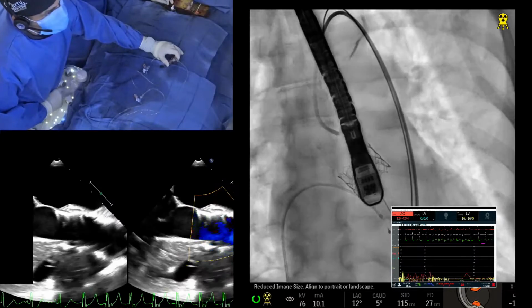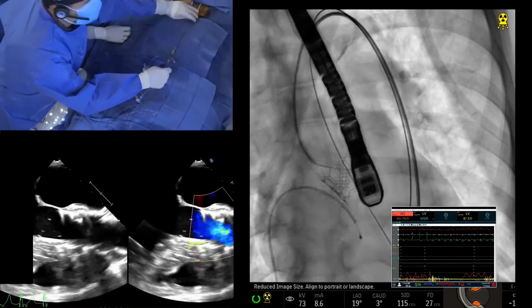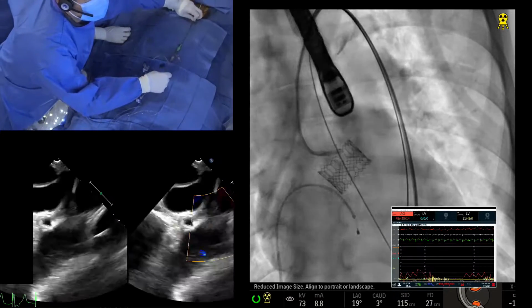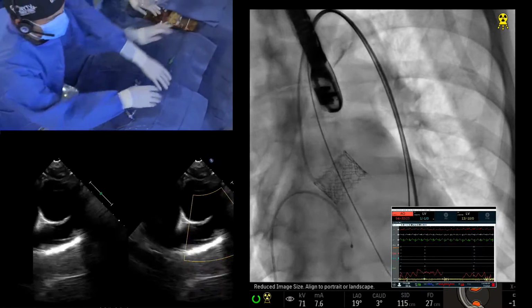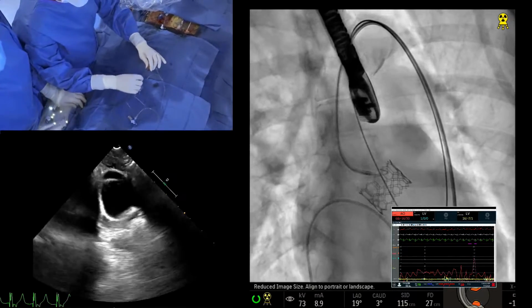You have a catheter through, is that right? No, just the wire. Yeah, it's the wire. So that's the wire. Can you bring the T probe up, please, Stam? We need to wire the left main now. Yeah, let's look at the left main. Give me a run through wire and get me my stent.